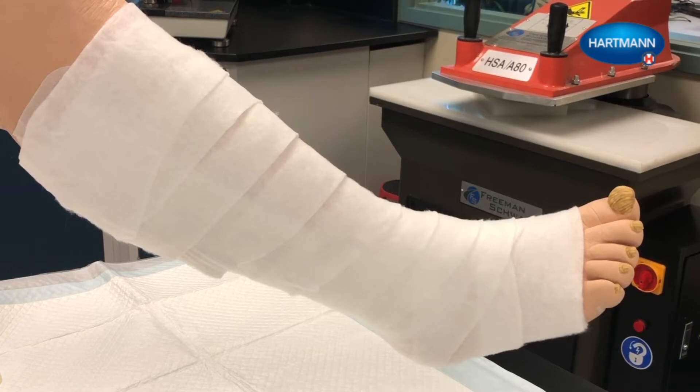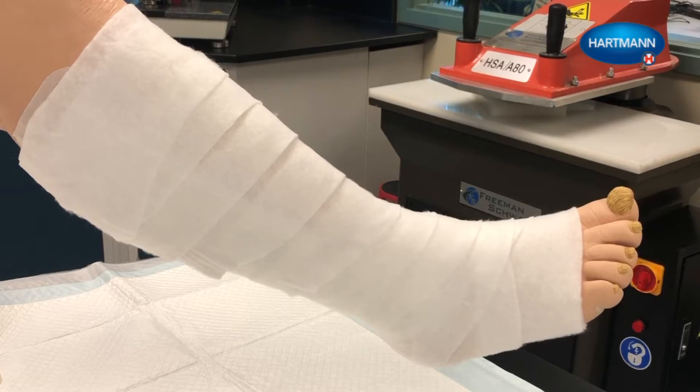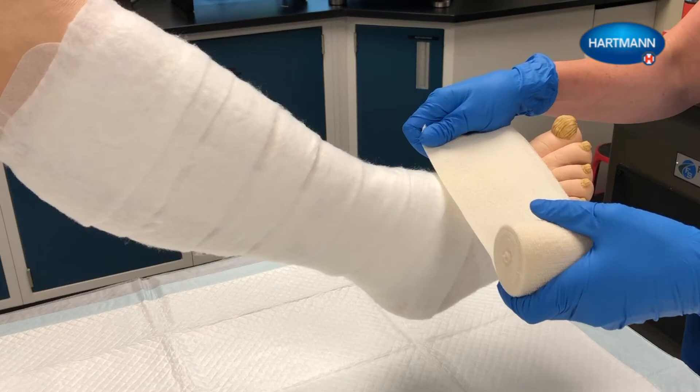Please note: when applying a compression system to the leg, it is important to enclose the heel with all layers of the system. When applying each bandage, make sure that the patient's foot is at a 90 degree angle to the lower leg. Hold each bandage so that it unrolls flat against the foot.